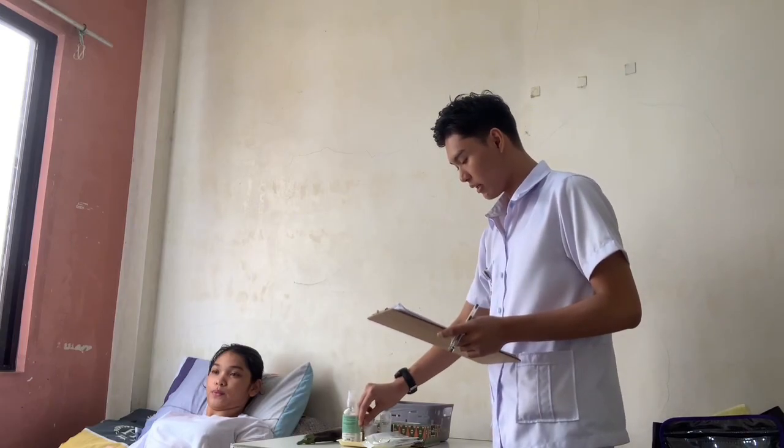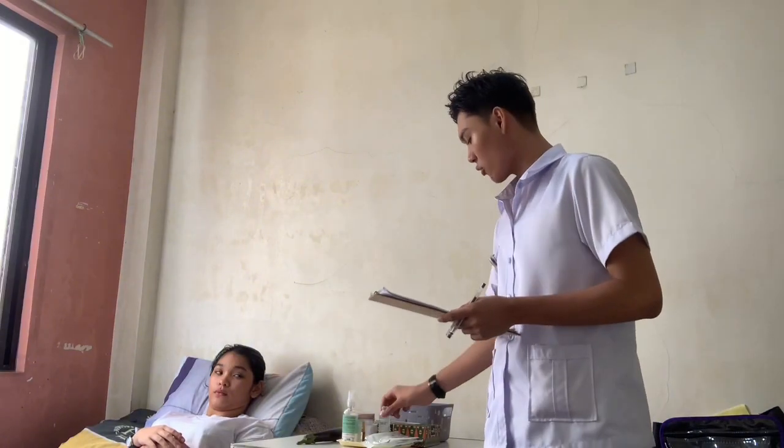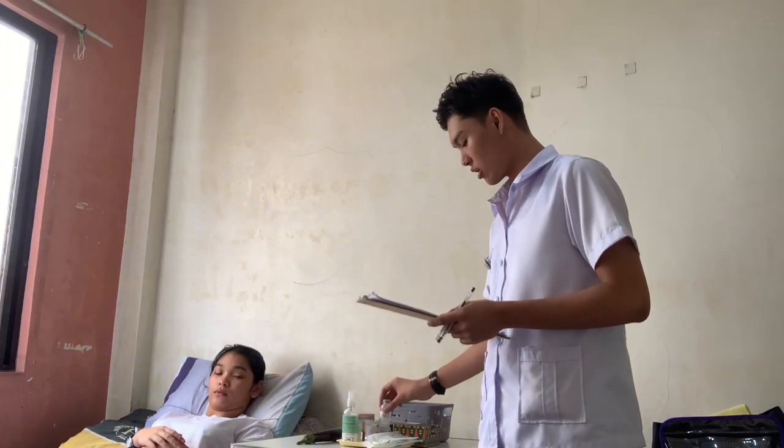Now, in medication administration, it is important to perform the 3 checks of administering medication. First, we read the label of the medication. Second, when it is taken from the medication cart. And lastly, we check it before and after withdrawing the medication.